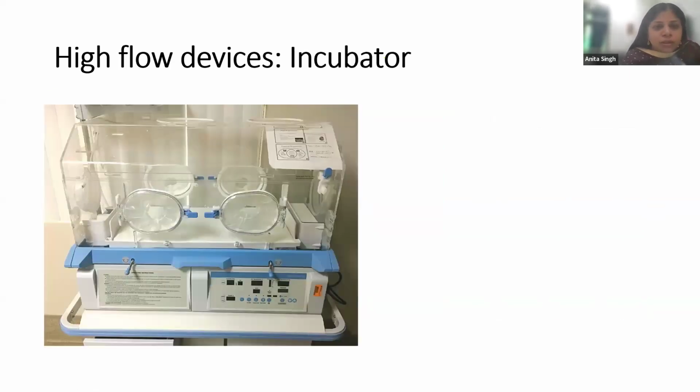Then one more high flow device is the incubator. Incubators, as you all must be aware, are used in neonatology for the care of preterm babies. Preterm babies often have a problem of FRC, and they would hardly be given simple oxygen therapy. But sometimes a case of BPD requires very minimal oxygen, around 21 to 23%. The incubators have a connection of oxygen and air port with an inbuilt blender system, which can be attached to the wall mounted system, and they have a display in which oxygen can be set for the FiO2 level, and it would be delivered inside.